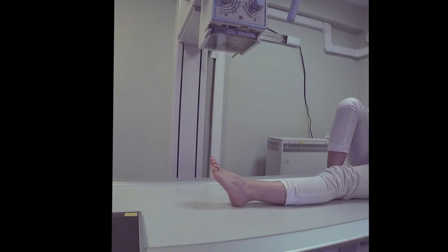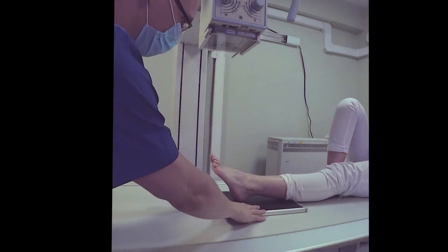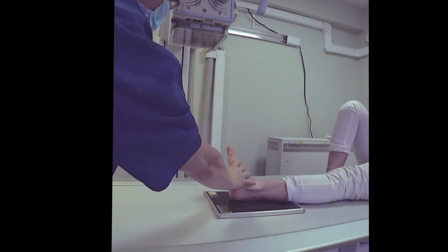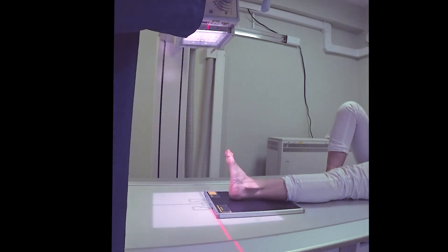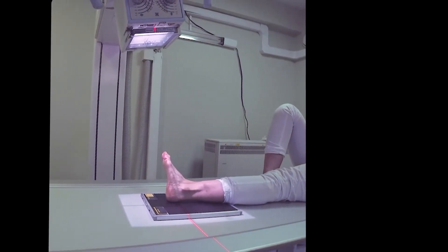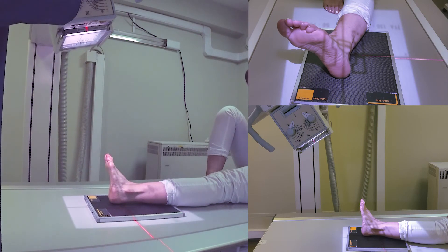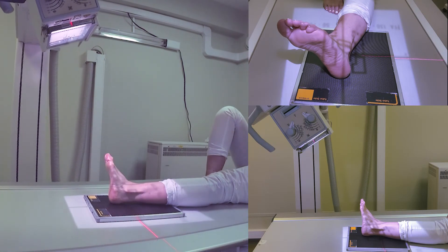Finally, the third main projection is Broden's view. Actually, it is not a single view but four consecutive views. The patient should be in supine position, the foot rotated internally at 45 degrees and flexed at 90 degrees to the shin. X-rays are centered on the lateral malleolus and directed from the plantar surface of the foot at 10, 20, 30, and 40 degrees.